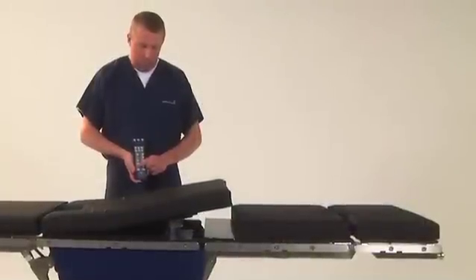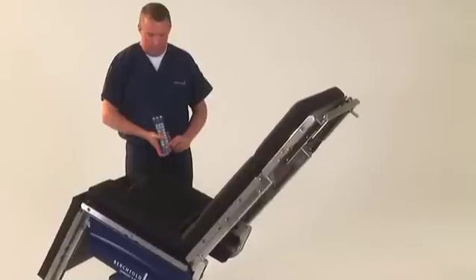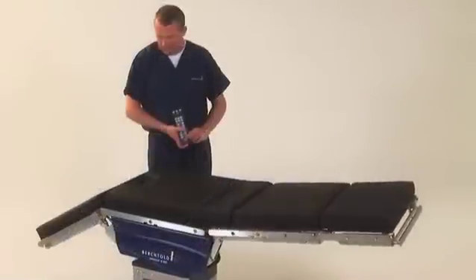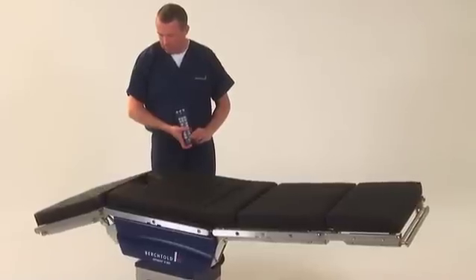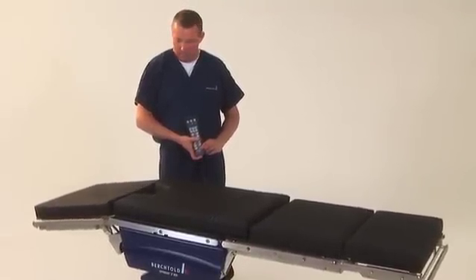Additional functions include elevation of the kidney area, flex or reflex, and automated beach chair positioning at the single touch of a button. Once the procedure is complete, the table will return to level position in the anatomically correct sequence when the level button is pressed.